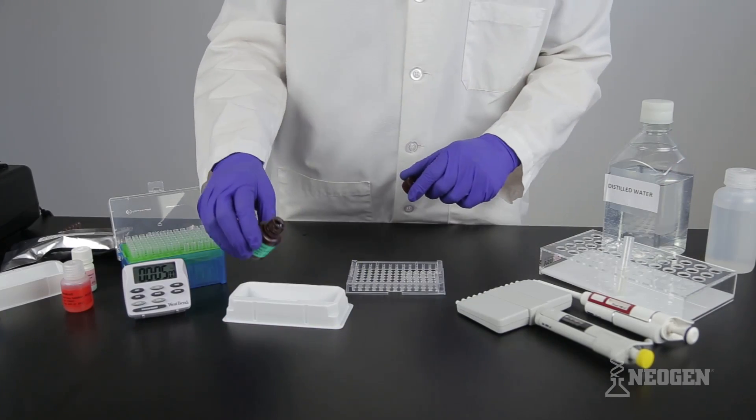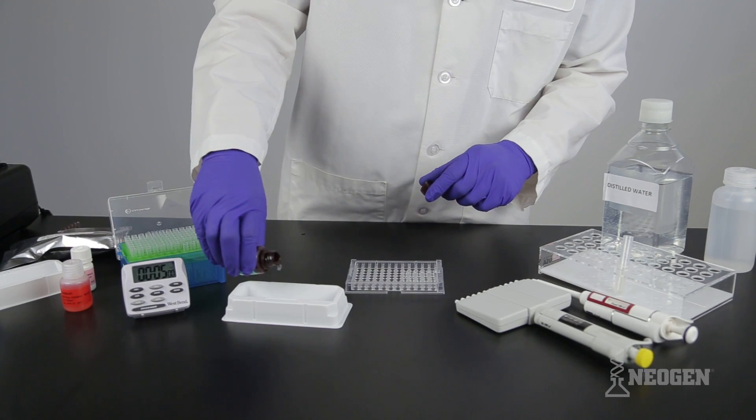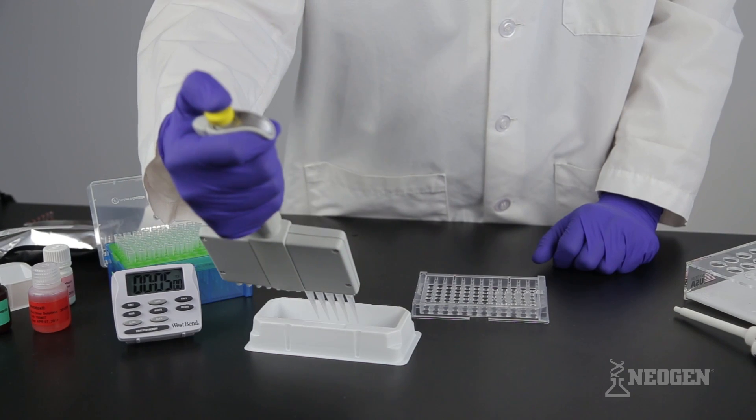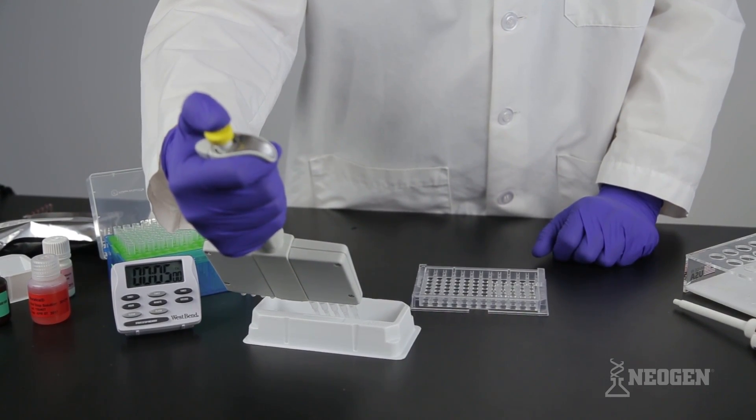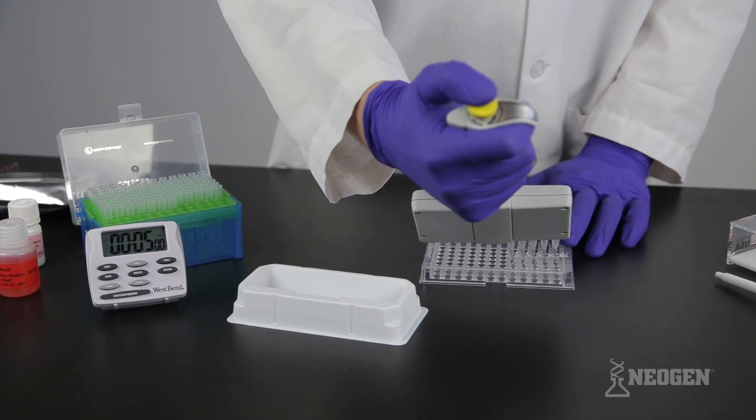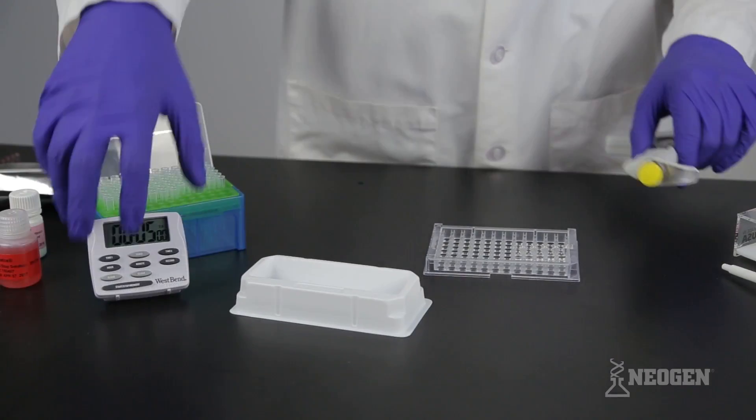Pour the needed volume of substrate from the green labeled bottle into a clean reagent boat. Using new tips on the 12 channel pipetter, prime and pipette 100 microliters of substrate into the clear microwells. Start a timer set for five minutes.